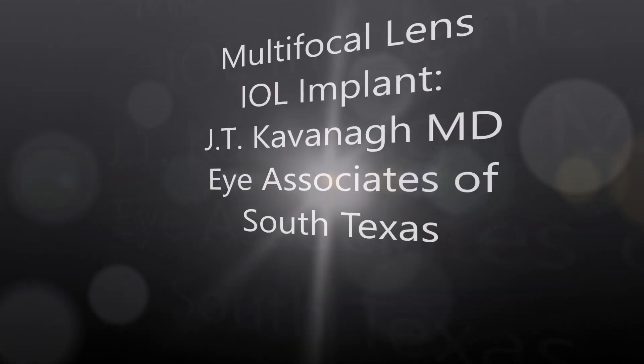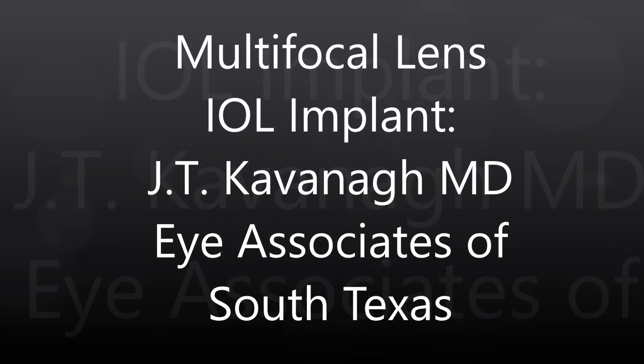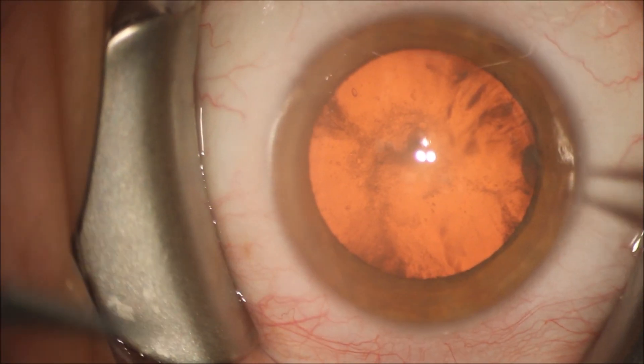This is Dr. Kavanagh of Eye Associates of South Texas. I'm going to show you a multifocal lens implant that we placed after cataract surgery.